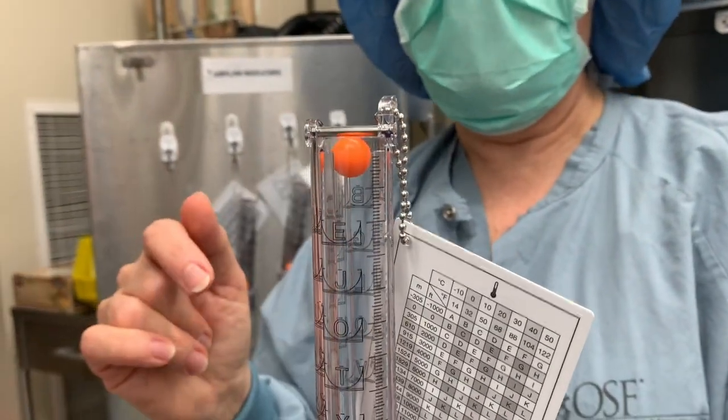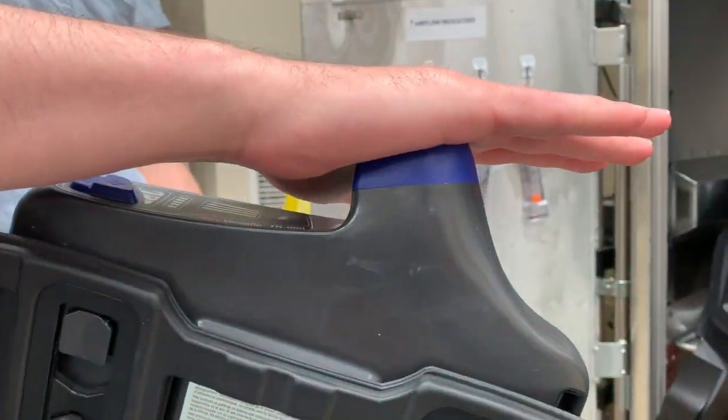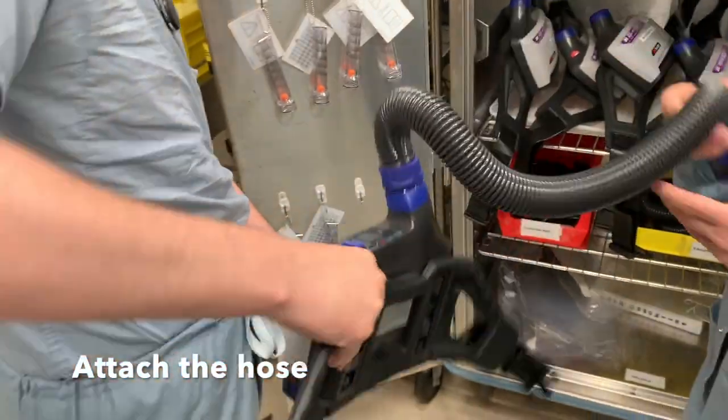If the ball is not above level E, it did not pass the test. You would then do an occlusion test, which also takes a little bit of time. You need to make sure all the red alarms go on — it beeps and vibrates.